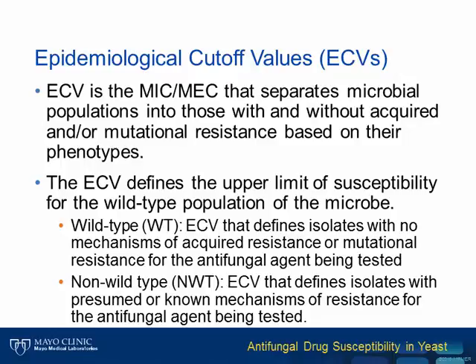Epidemiological cutoff values, which are sometimes referred to as ECVs or ECOFFs, represent the MIC value that separates microbial populations into those with and without acquired or mutational resistance based on their phenotypes. The ECV defines the upper limit of susceptibility for the wild-type population of the microbe.